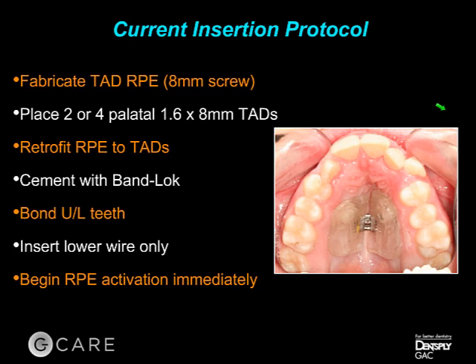If we're doing just an expander alone, we will allot 45 minutes for the appointment, and that gives us enough time to place the TADs, place the expander, and go over instructions and expectations. So this is something that fits very easily into the routine of the day and causes minimal disruptions. And like I said, it's a lot more comfortable for our patients.